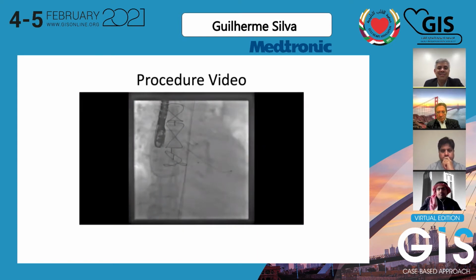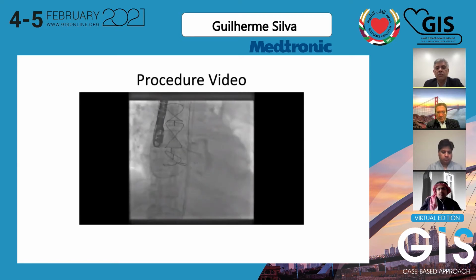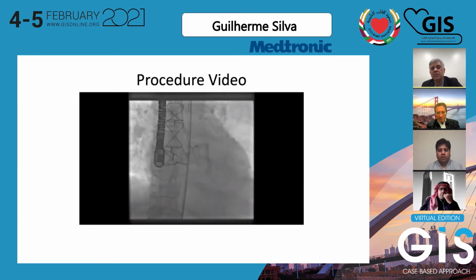So here we're crossing the valve, and now we put a long J, and this is Dr. Simpson, and we put in a pigtail catheter inside the LV to exchange. In this case, we thought about using a Lunderquist, which is a very stiff wire. I thought the Lunderquist was going to bias us to the outer curve and make it difficult to deploy the CoreValve. So we decided to go with a Safari wire, which is a less stiff wire. And it's very friendly inside the ventricle, especially for those little ladies. Now it's a little bit better. And you see that the Safari wire took us very much into the middle of the valve, which is what we wanted.